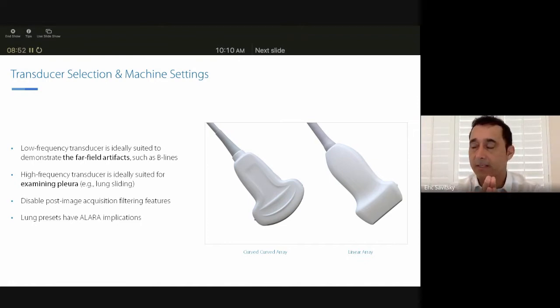So when I first started doing lung ultrasound, I was really wed to high frequency linear transducers. And in neonatal and young infants, that's a great modality, and you usually can get everything that you want. But as I started to use it in adult patients or older pediatric patients with bigger body habitus, you will have progressive value in your curvilinear transducer just because of the deeper image penetration of the signal.